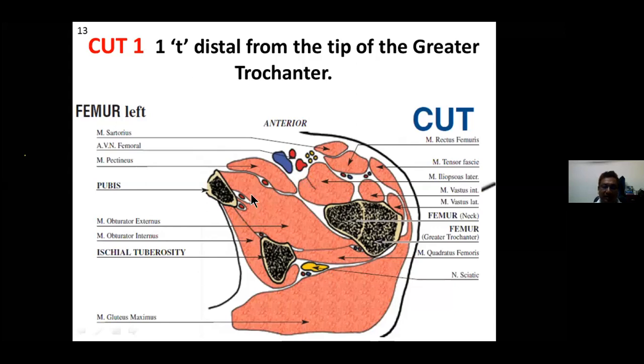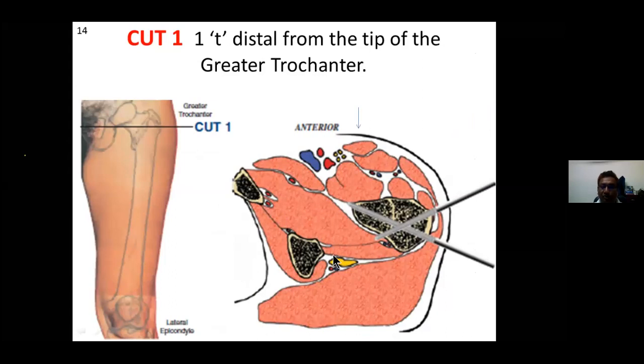And in this case, transosseous fixation should be from the lateral side. Schanz screws are preferred. At this level, the recommended fixation is performed using half pins, one inserted from the anterolateral to posteromedial, and the second from the posterolateral to anteromedial. The 2 pins are angulated at 30 to 40 degrees.